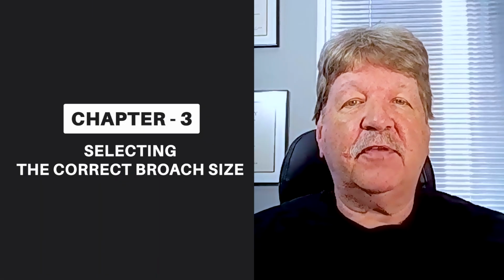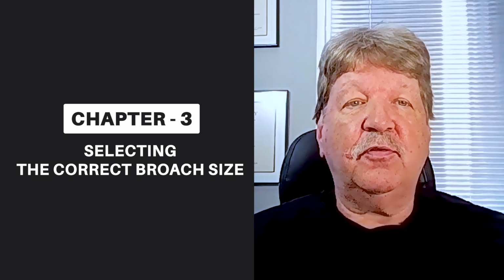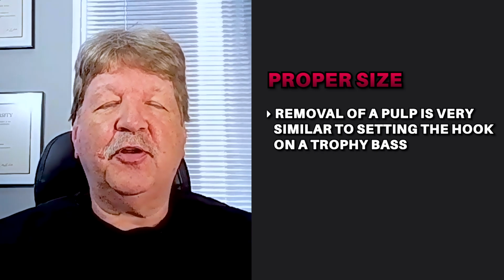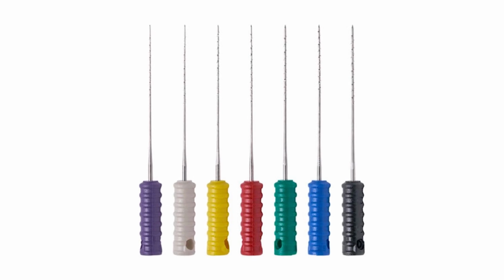One of the biggest mistakes I see is that clinicians do not have appropriately sized broaches that allow them to do this properly. Removal of a pulp is very similar to setting the hook on a trophy bass. The hook can't be too large or too small. Selection of the proper size broach is critical. Broaches come in sizes from XXX fine to extra coarse.